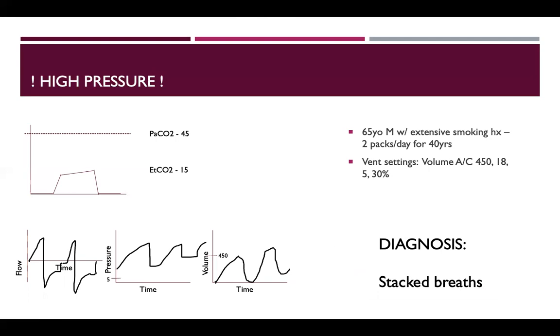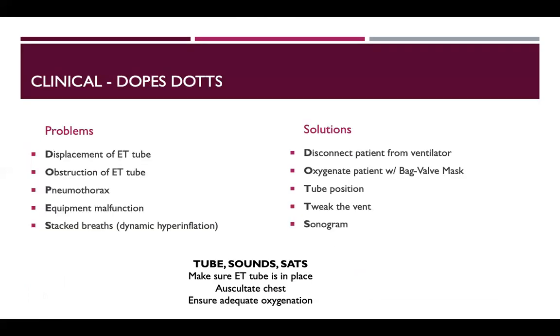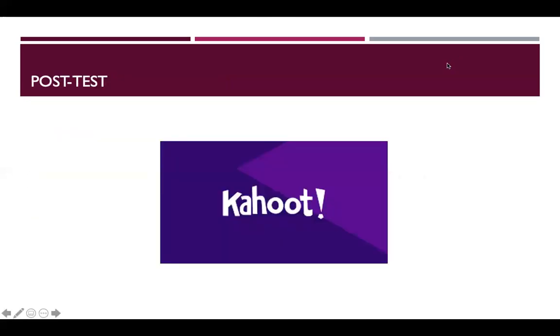All right. So if you were to put this all into the acronym, this is what it would be. This doesn't correlate one-to-one. This is just different problems and solutions that come together to say DOPES and DOTS. And then, yep, that's it.